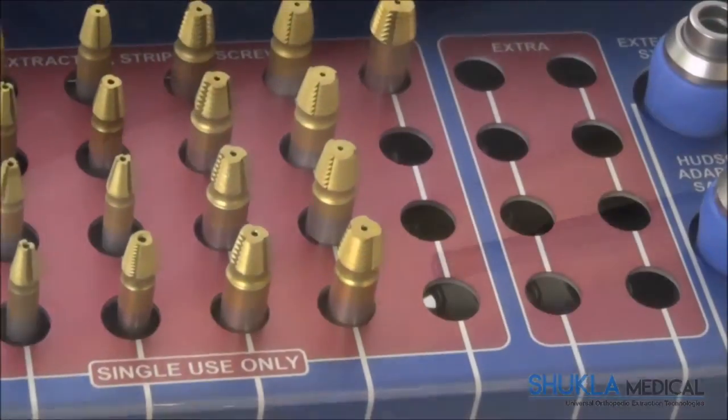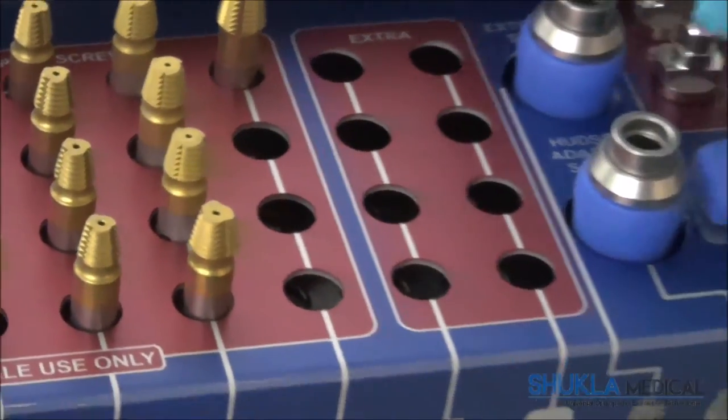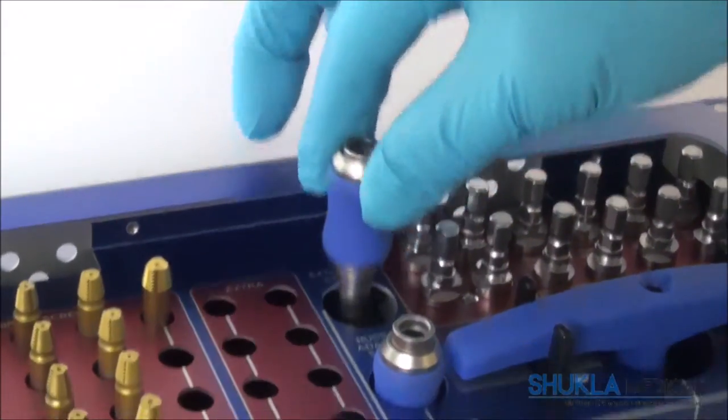To the right of the stripped screw extractors are two empty rows, designed for additional screw extractors if needed.